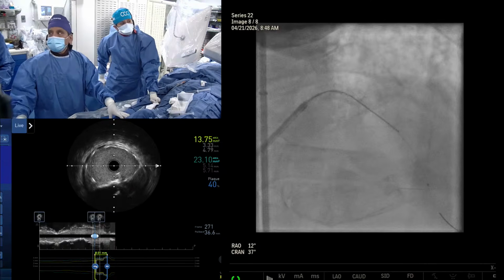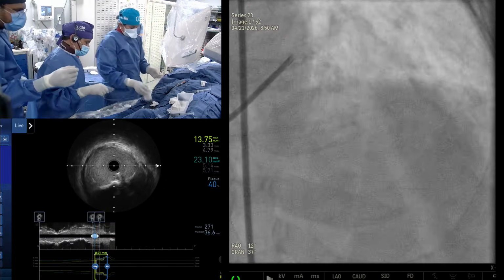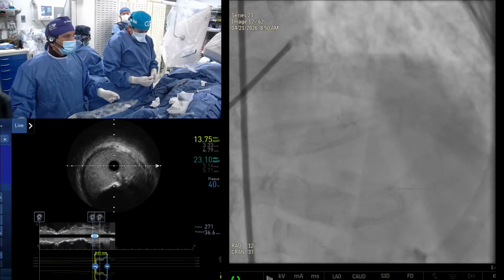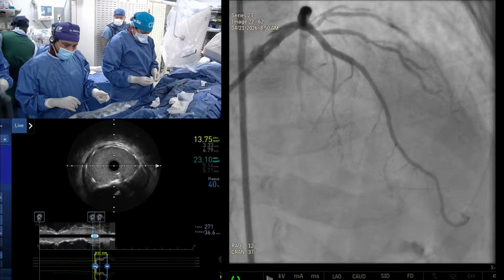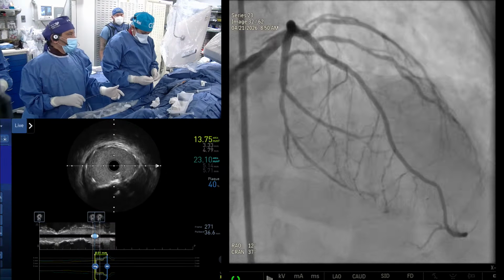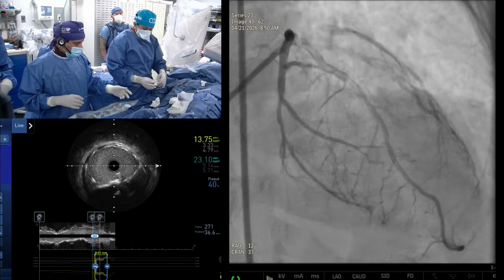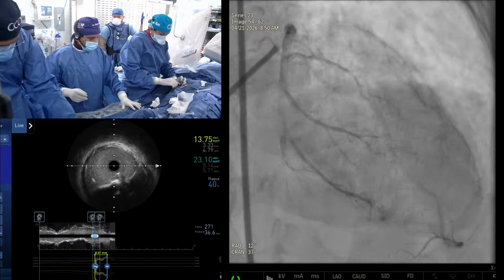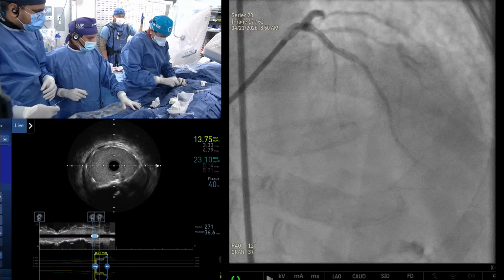And we went only like 16, 18. We were very cautious. Only question is 4. I think just believe your eyes. You know, Samir, what I was going to tell you about not using the torquer: like we say, use your eyes for everything. Use the tactile sensation in the fingers. So, God-given sensory. You've got to train yourself to do all that. Keep training, and you'll get better at it.